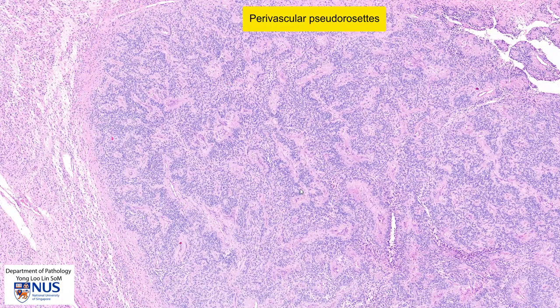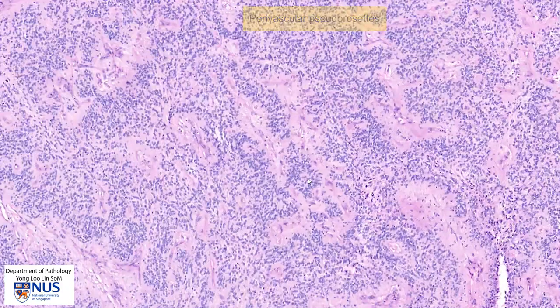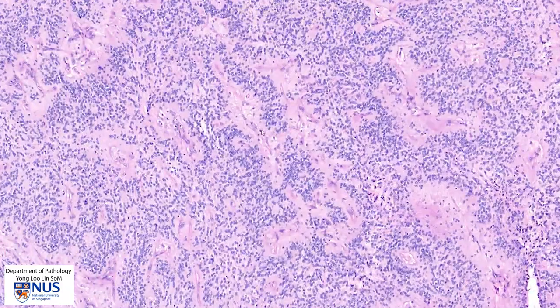We can also appreciate them very clearly here, and we can see that there is a central blood vessel, this pale fibrillary zone, and then the nuclei around it. These are perivascular pseudorosettes.